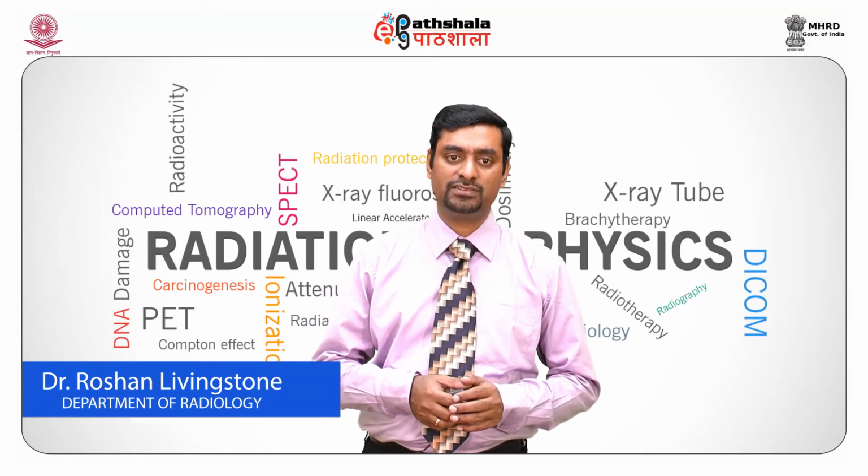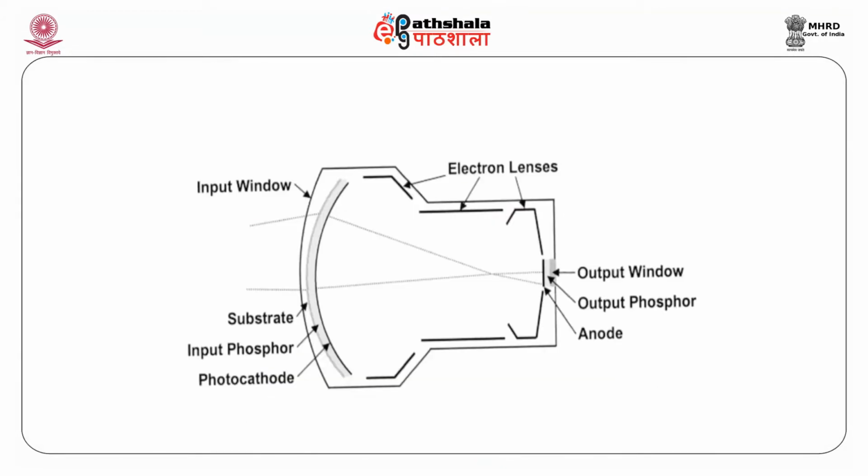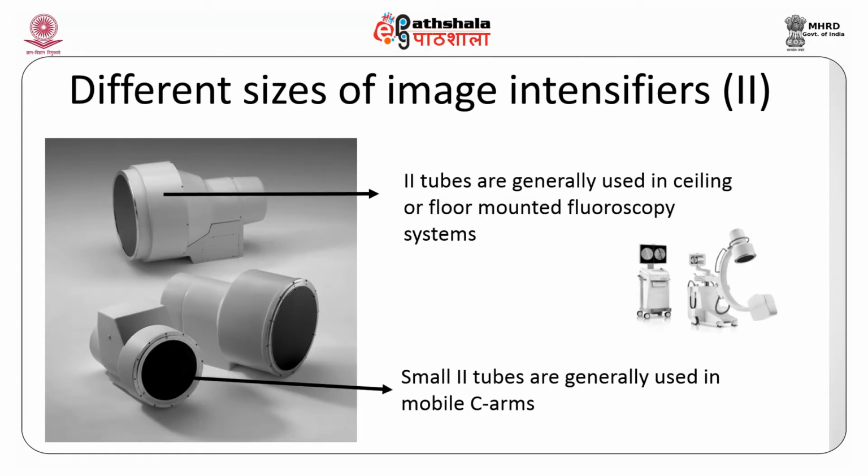What are the main components of this image intensifier? It has an input phosphor and a photocathode, electrostatic focusing lens, an accelerating anode, and output phosphor. These are the main components. From this figure, we see various types of image intensifier tube that are generally used for ceiling mounted or floor mounted fluoroscopy systems. Small image intensifier tubes or II tubes are used in C-arm machines. C-arm machines are used in the operation theatre.